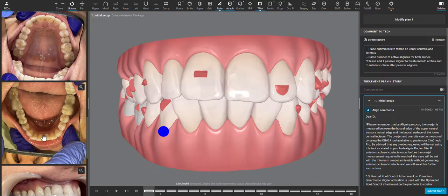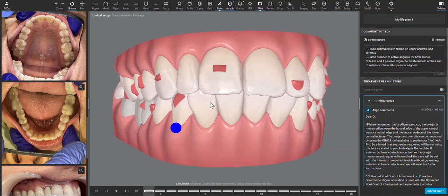Hi, I am looking at this case with the goal of creating space around this upper right lateral to match the contralateral side, and that's absolutely something we can do with Invisalign.